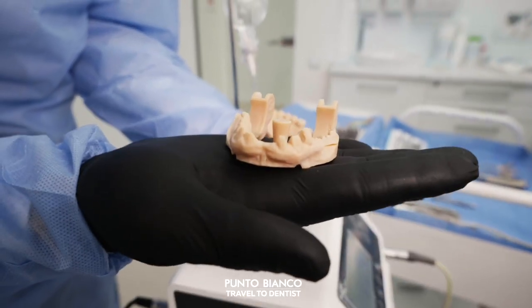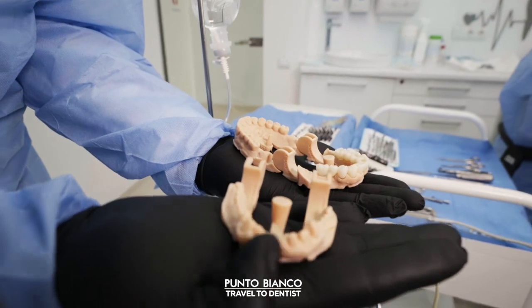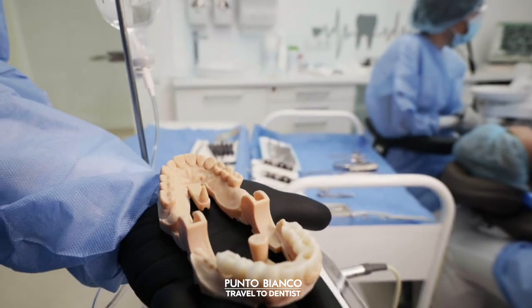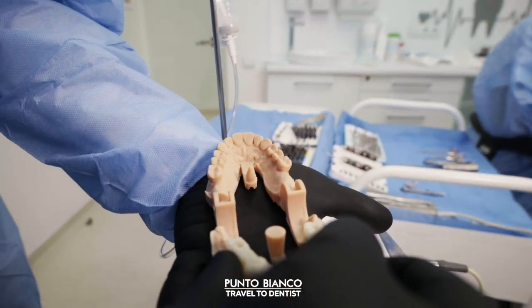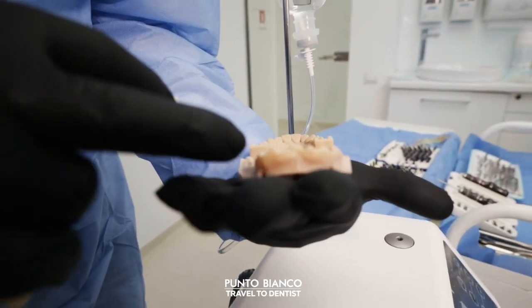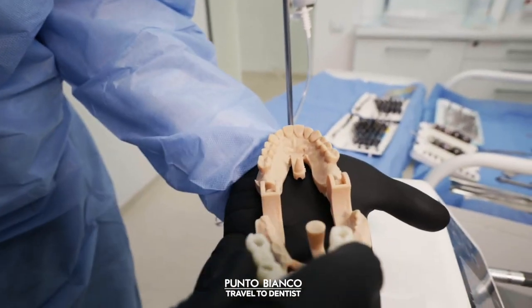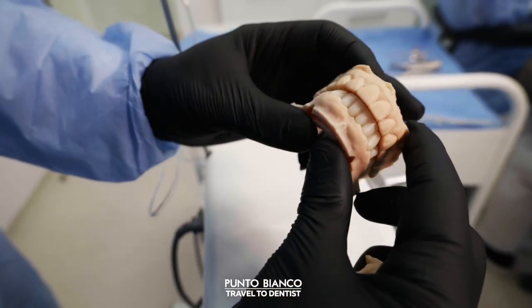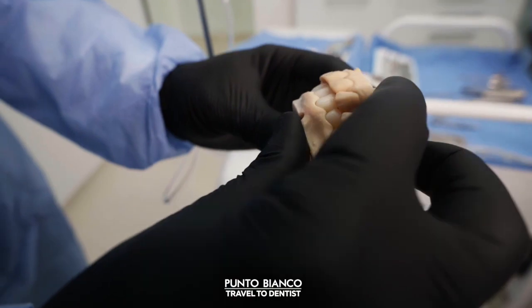So this is the initial situation with the patient with the teeth still present. Here is already the model of the extracted teeth. This is an illustration of how our patient should look after the surgical procedure has been completed and proper care has been taken. These are the teeth prepared prior to the surgery. That is how the patients should emerge from our surgery.